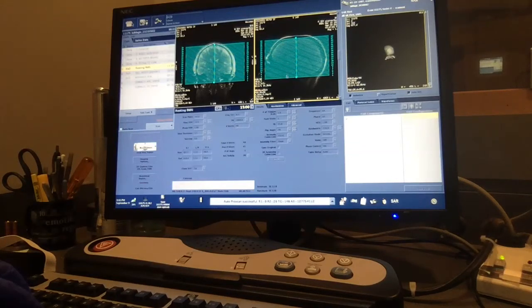With that number of slices, because this is a 2D acquisition, you see each slice laid out here on the console. The echo time is 25 milliseconds. We have a flip angle of 70 degrees, and our k-space sampling is much less than those structural images. This scan is set to be 15 minutes long.